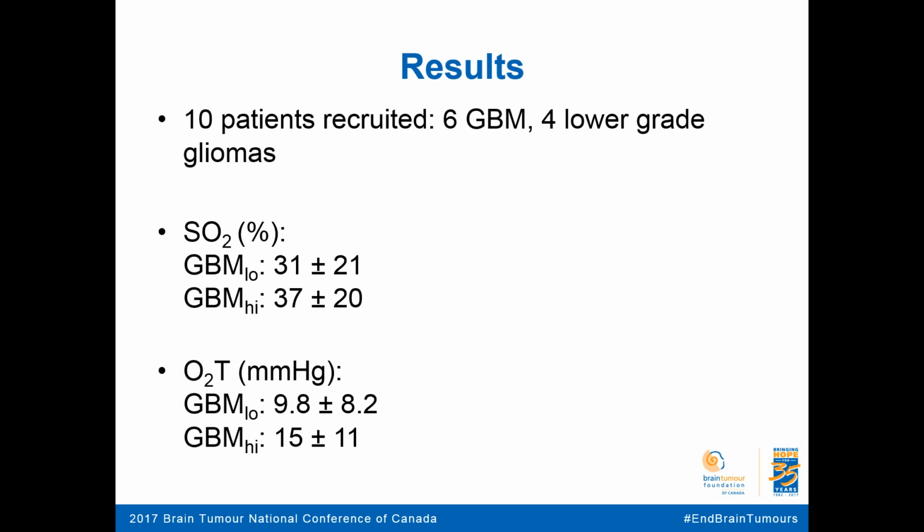So you may initially say, okay, these numbers don't match, but remember what we measure in MRI is oxygen saturation. What we measure with Lycox is tension. So there is a lot going on to translate oxygen tension in the tissue to oxygen saturation, depending on local tissue pH, local temperature, oxygen that comes in blood, in arteries, oxygen that goes in veins, oxygen that the patient breathes, and everything is changing.